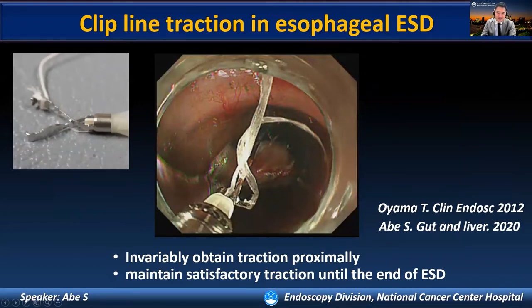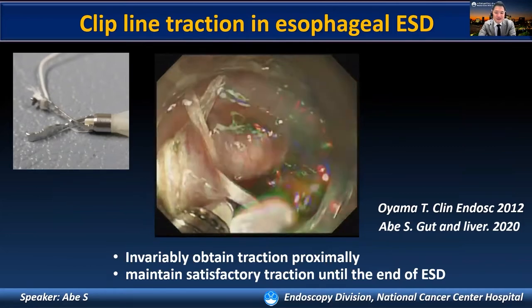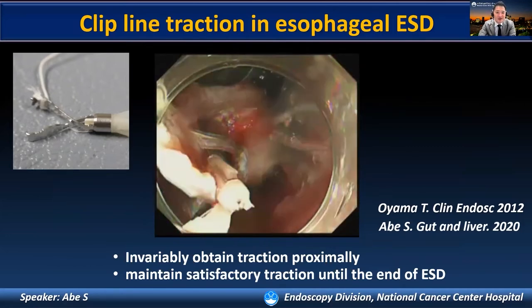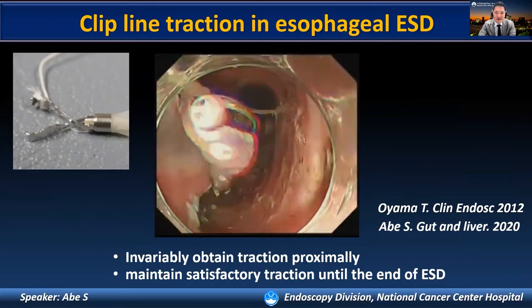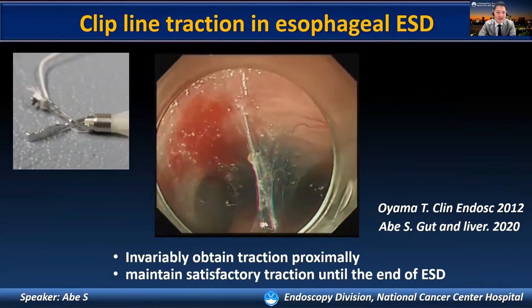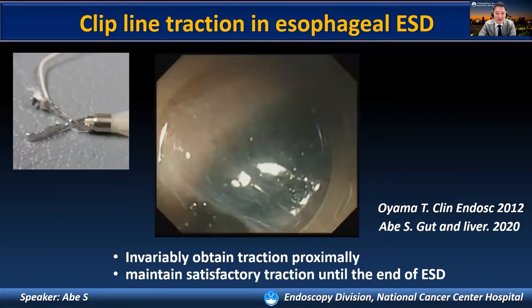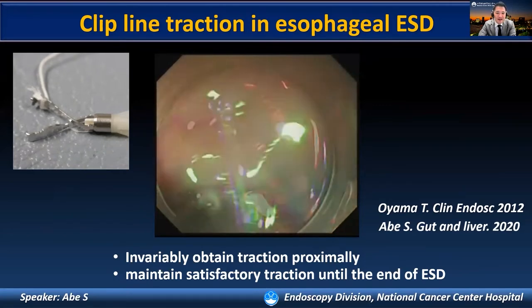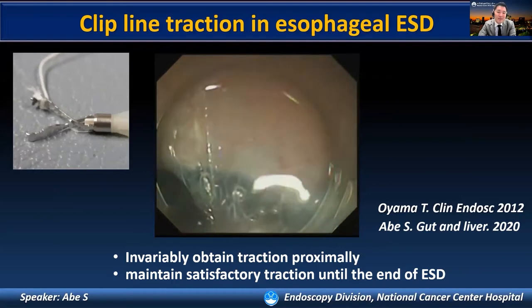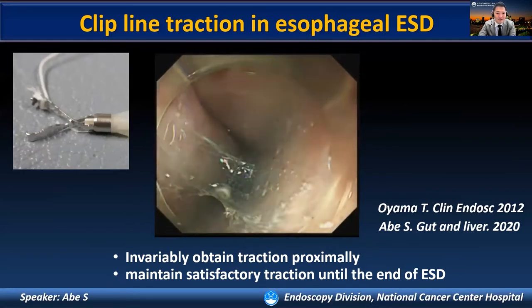After submucosal dissection of the left distal side, the clip-line traction technique is commonly used during esophageal ESD. A line — typically dental floss — is tied to an end clip outside the patient, and the clip with the line is deployed to the backside of the specimen. When the line is pulled through the mouth, the submucosal layer is well exposed and lifted up with sufficient traction. We hook the IT knife nano to the edge of the submucosal, and the submucosal dissection is nicely performed parallel to the muscle layer.